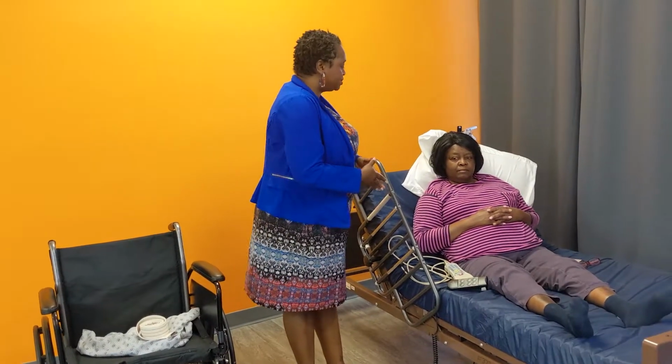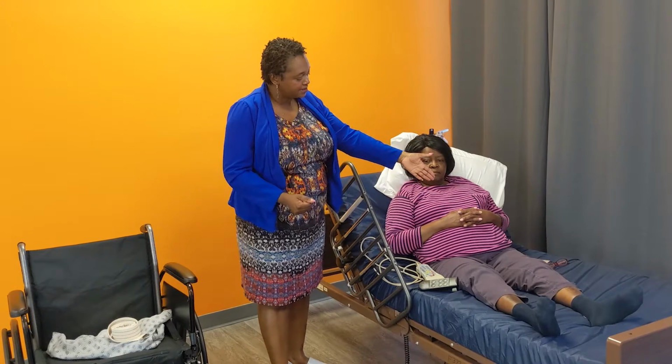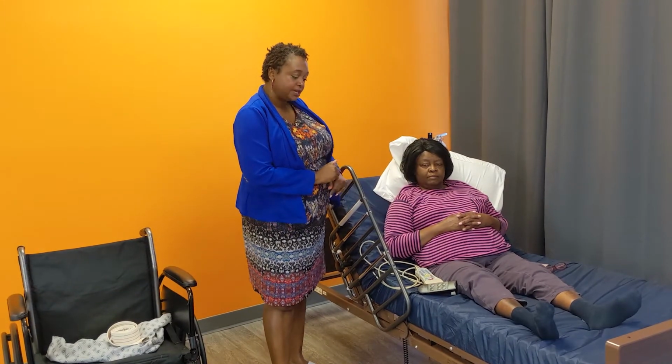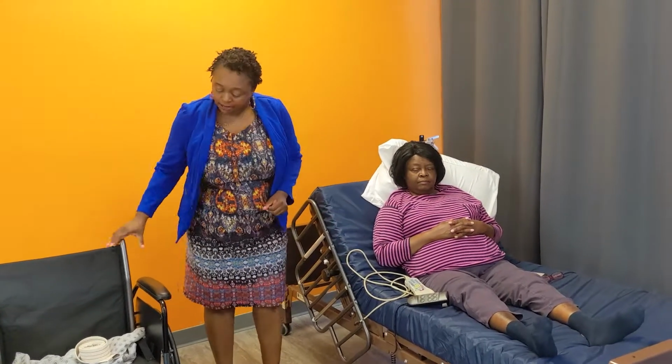So what I'm going to do now, I'm going to deal with objects first. The patient's already in a sitting position, which is good. She could use the assist stand device, which is the side rail, but actually for a pivot technique, I'm going to bring the side rails down. Okay, I'm going to bring the side rails down.